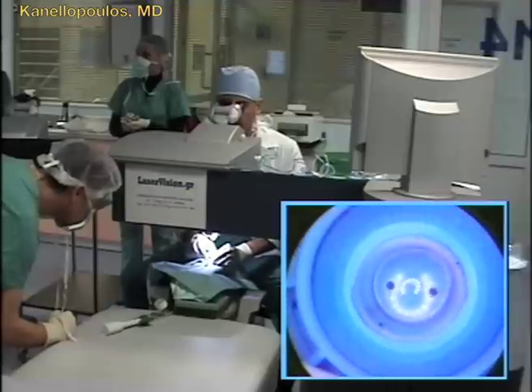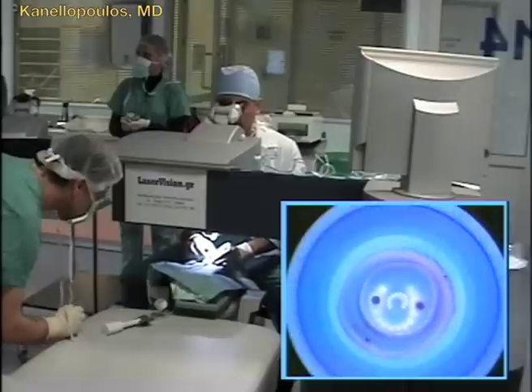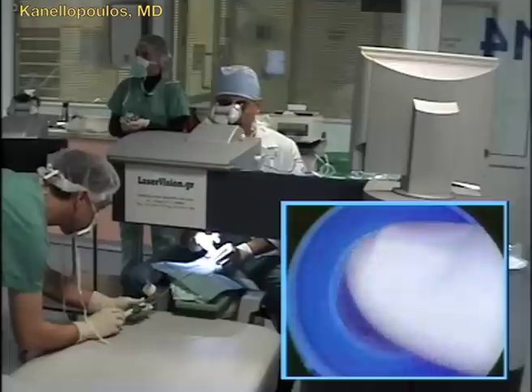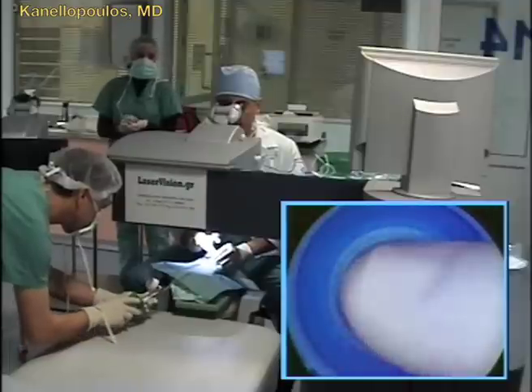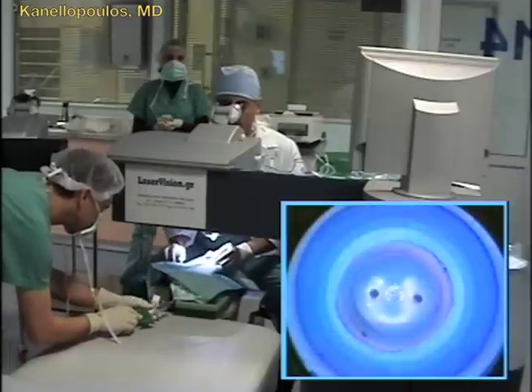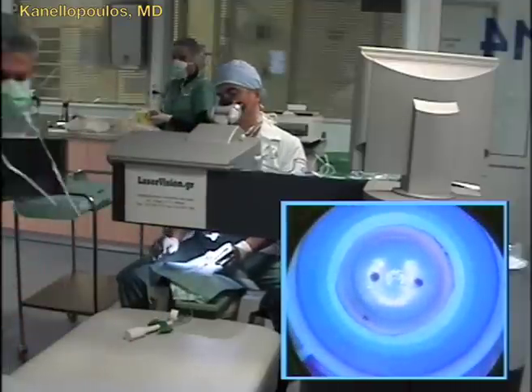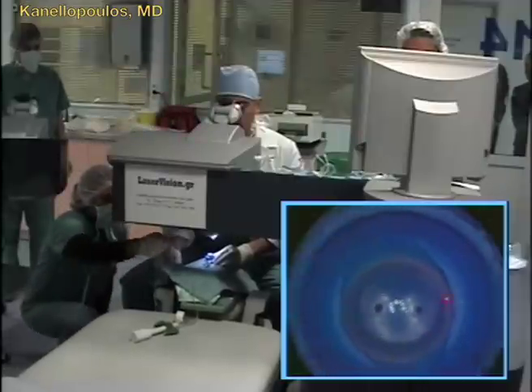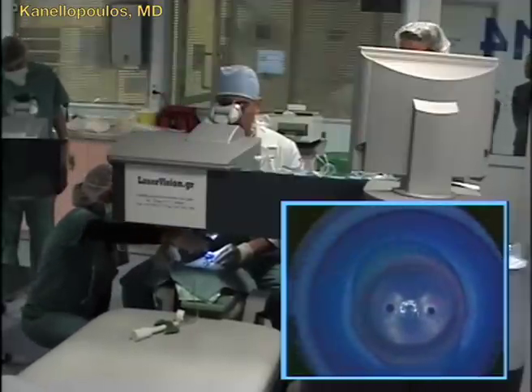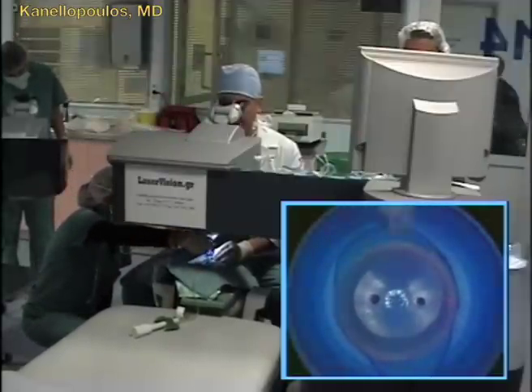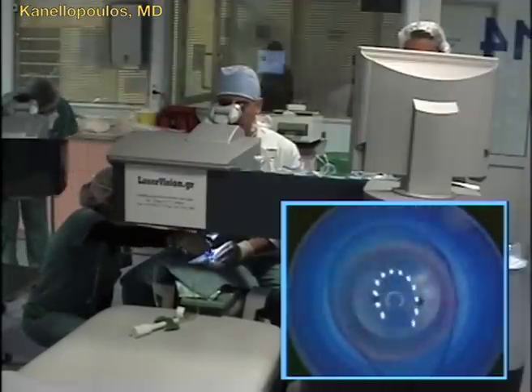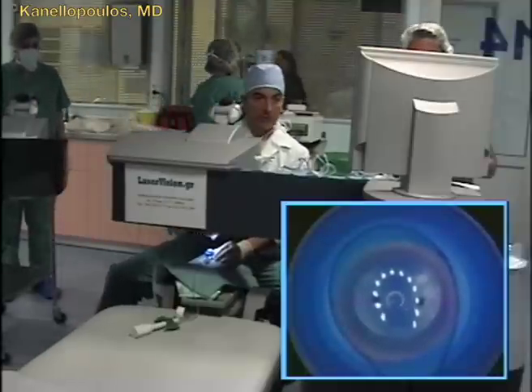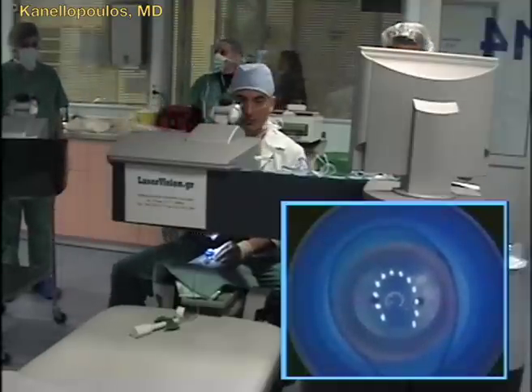So we will oversize this graft just by three notches of a millimeter — we trefine the host at 7.5 millimeters and we'll trefine the graft to 7.8 millimeters. As you can see here, a drop of Vigamox to attain good lubrication of the surface and, of course, antibiosis.